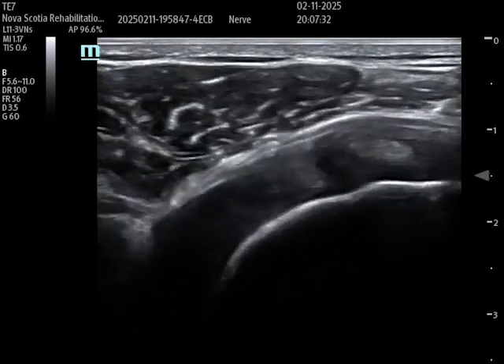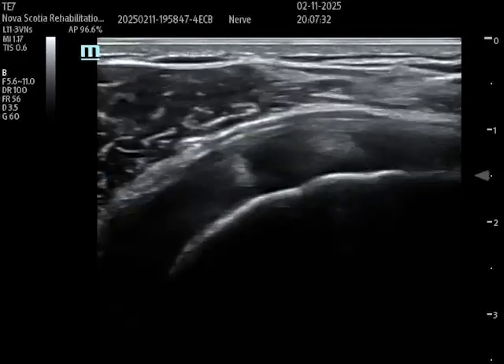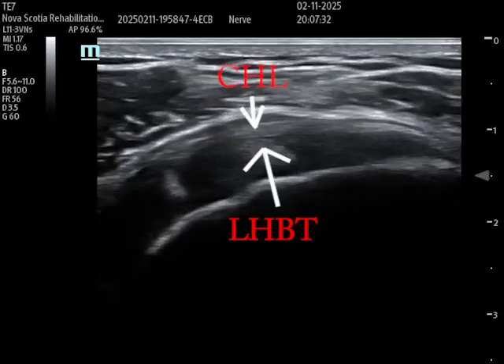I've now moved the probe slightly laterally. What I've identified is the subscapularis tendon, marked with the white arrow, with the overlying deltoid. Although it's not marked here, to the right of the subscapularis tendon that hyperechoic structure is the biceps tendon.